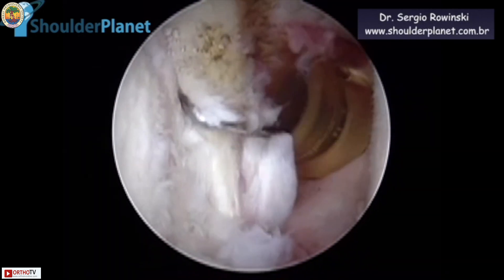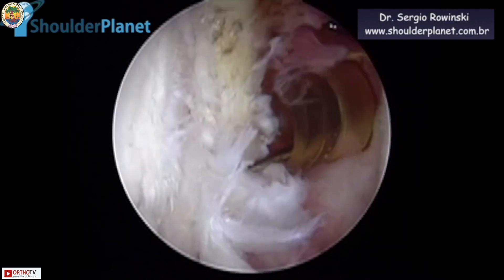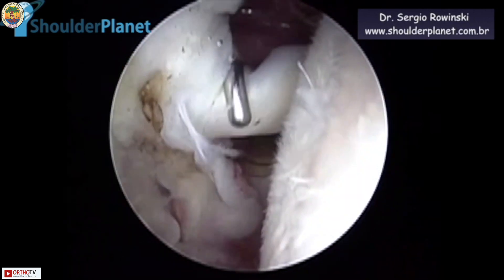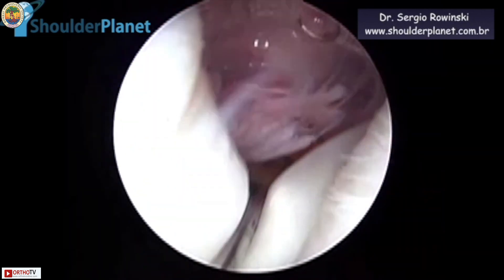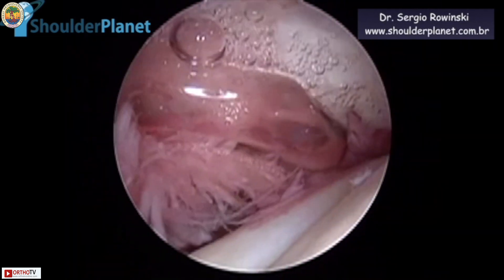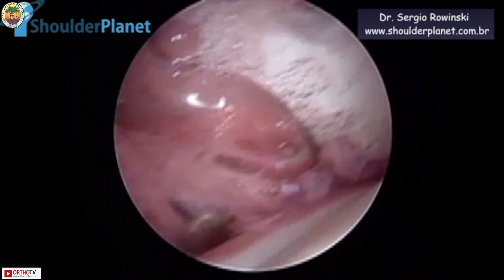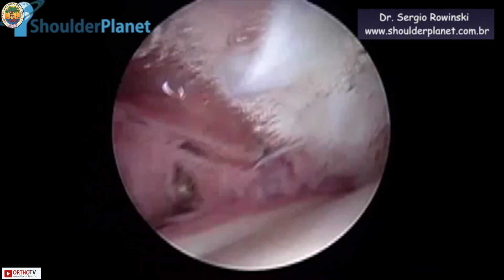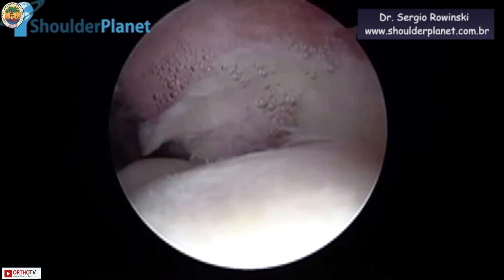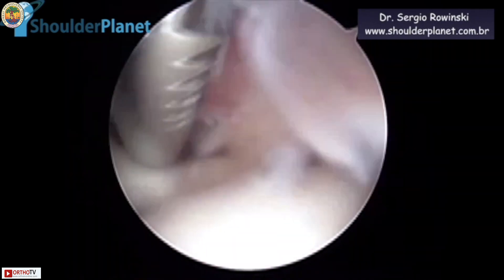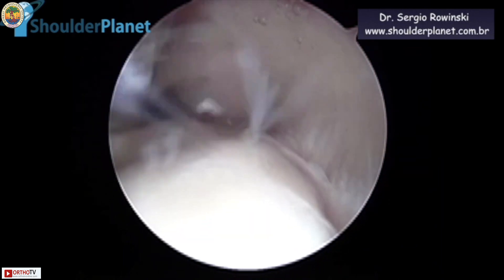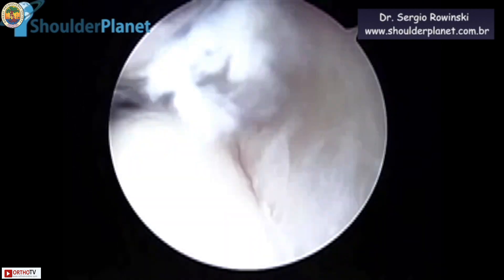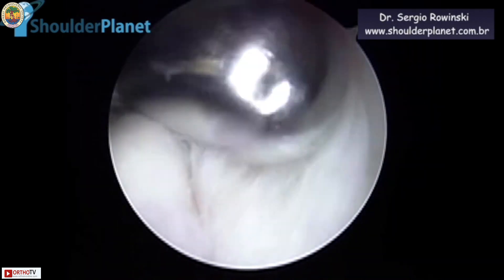As a next step, we started to test the long head of the biceps. This is something very important to do in the arthroscopic evaluation of the shoulder. His biceps was really in a nice state — no signs of fraying or even subluxation. We have seen a very healthy tendon. After that, we performed on the articular side a very slight soft debridement of the articular margin of the posterior superior cuff. We knew that cuff would very probably be in a nice state, and it was. This is what we have seen.